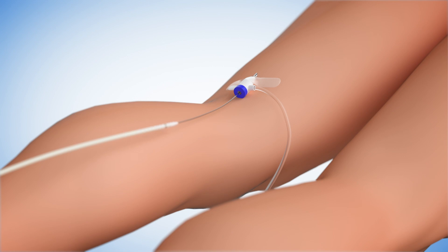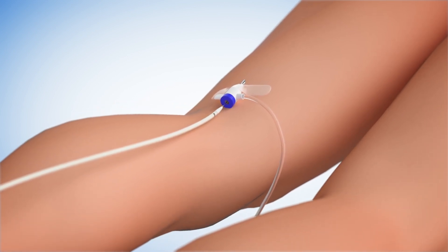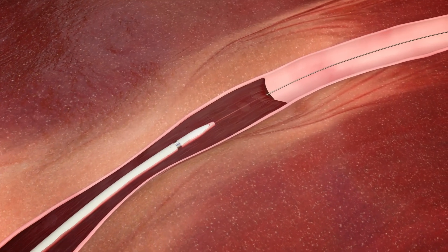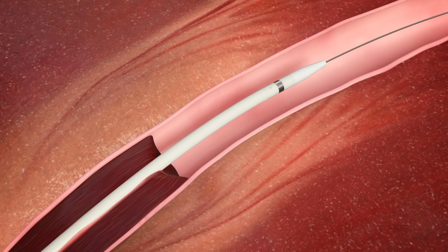The Pounce Venous 10 French catheter is inserted over a guide wire from an access point behind the knee, then advanced past the treatment location. The Pounce Venous catheter has four side holes for infusion of physician-selected fluids.